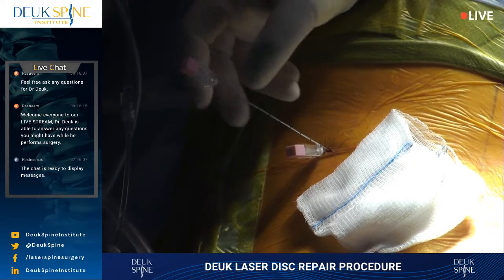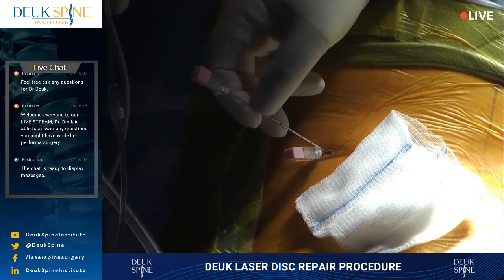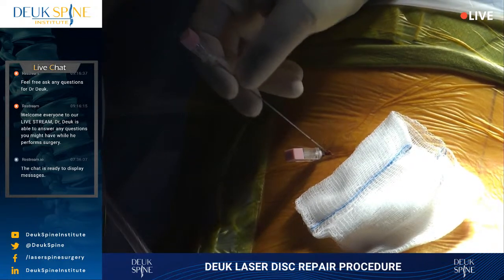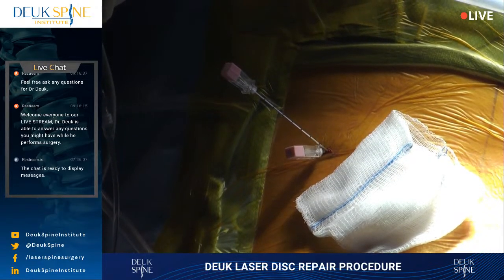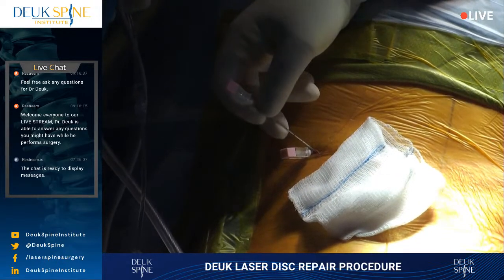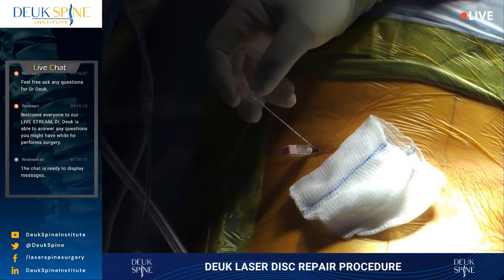So then, what else could cause pain? Well, if you notice, there's a fractured bone on this x-ray. So we tested that to make sure that wasn't the cause of pain, because I wouldn't want to be operating on someone's disc when the cause of their pain is a fracture. Because fixing their disc won't fix the fracture. So we had to make certain that the fracture was not the cause of pain before we recommended treatment, because fixing a fracture is different than fixing a herniated disc. So we determined the fracture was not the cause of pain for this patient, and then we recommended fixing the discs, which are the cause of pain, in my opinion, based on the patient's location of their pain.